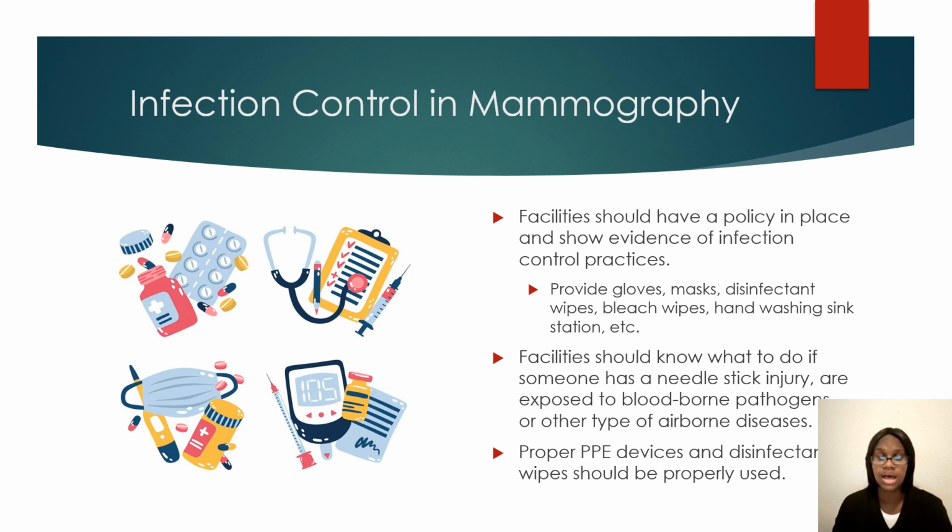Like if someone is coughing, I wear my mask whether someone is coughing or not because I think a lot of people are doing this, especially since COVID, where we just have been wearing our masks more, or especially if we're very close to a patient whenever we're taking their mammograms. I may greet them without my mask, but whenever I'm taking a picture, I have my mask on. Make sure that you are using disinfectant wipes or spray properly. Wear your PPE when needed.